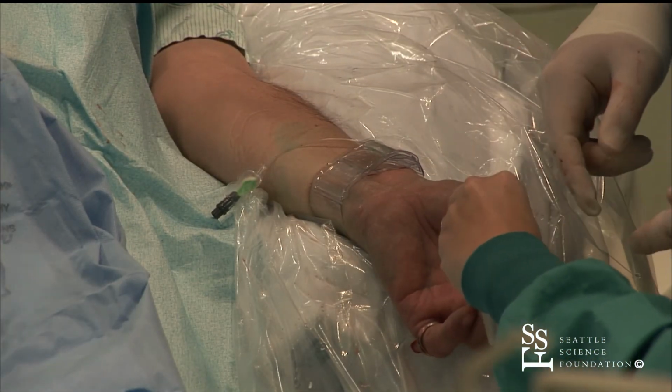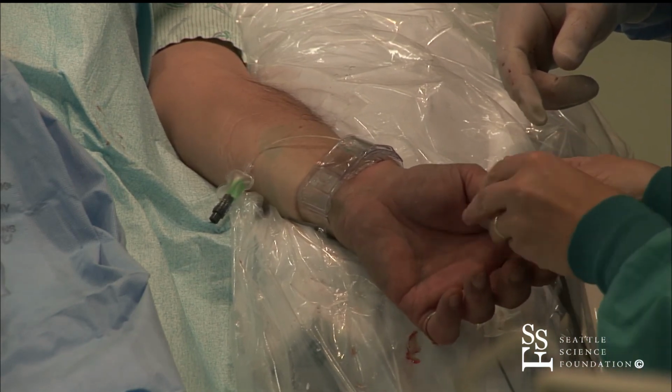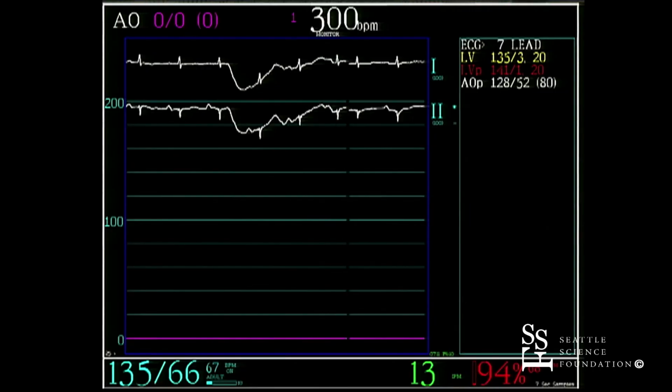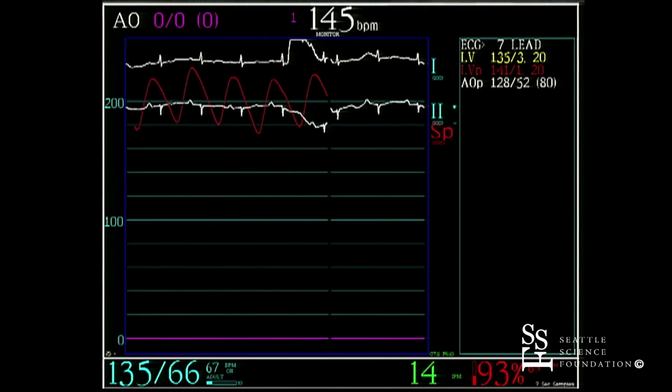Over the thumb. Yeah, thanks. Yeah, I know, but for the test we need to do that. So I don't know if we can bring up the pulse ox on the, okay. Can you put the waveform up, Diane? Yeah, okay, great. Oh, there it is. Okay, perfect. So now you see the waveform there.